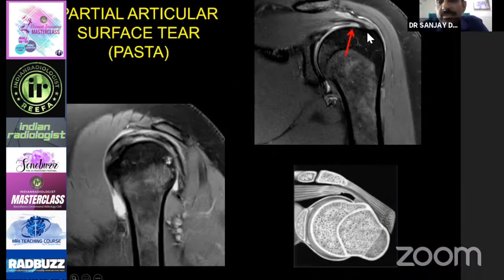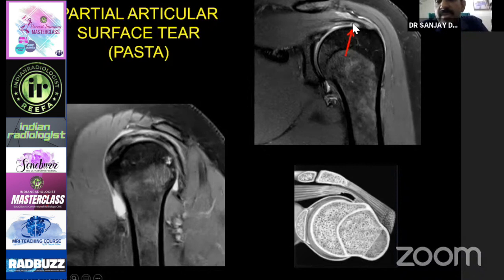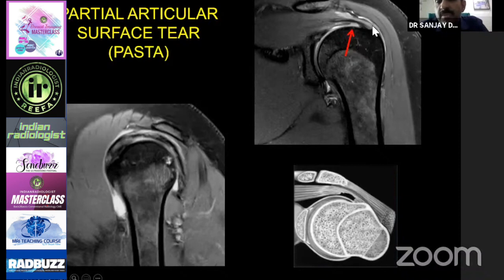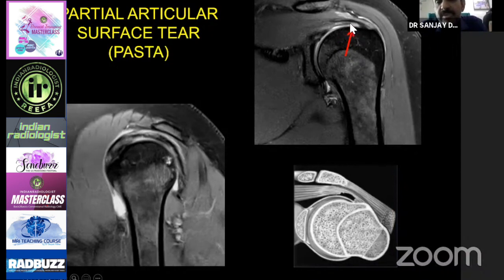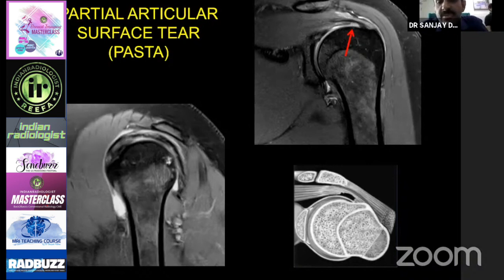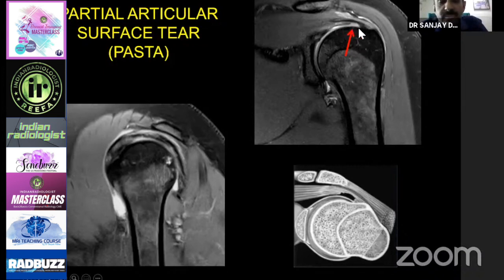This is an articular surface tear. The foot plate of the supraspinatus inserts over the greater tuberosity — there is no articular cartilage over the greater tuberosity; articular cartilage starts and ends at the humeral head neck junction. A partial thickness tear involving the articular surface with slight retraction of the tendon is called a PASTA lesion — partial articular surface tendon avulsion. This means the tendon has avulsed and traveled a small distance from the insertion.